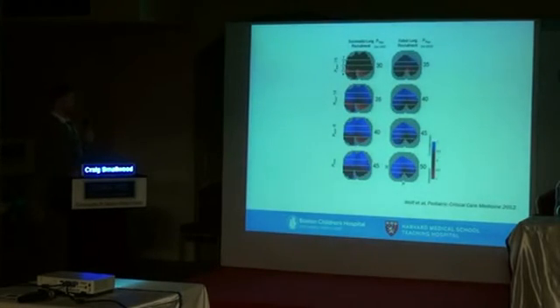And these are some of the results. You can see on the left-hand column, this was a successful lung recruitment patient. There were some patients who recruited and some who did not, and that was what we wanted to find in this study.